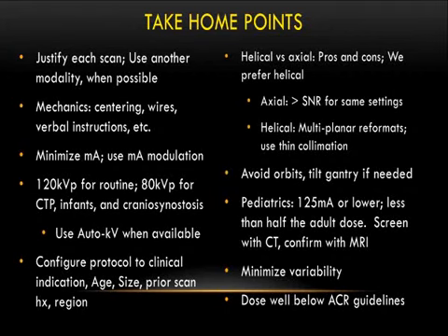Oh, one more question? Really appreciate your presentation, especially somebody else joining us in that low dose outlier group. But I think you were mostly talking about routine heads today. That's correct. Can you say a few words about what other protocols, that are still head protocols but maybe not routine, where you might be even more aggressive? Other kinds of things, temporal bones or facial bones or other places like that where we could really be even more aggressive than you've described.